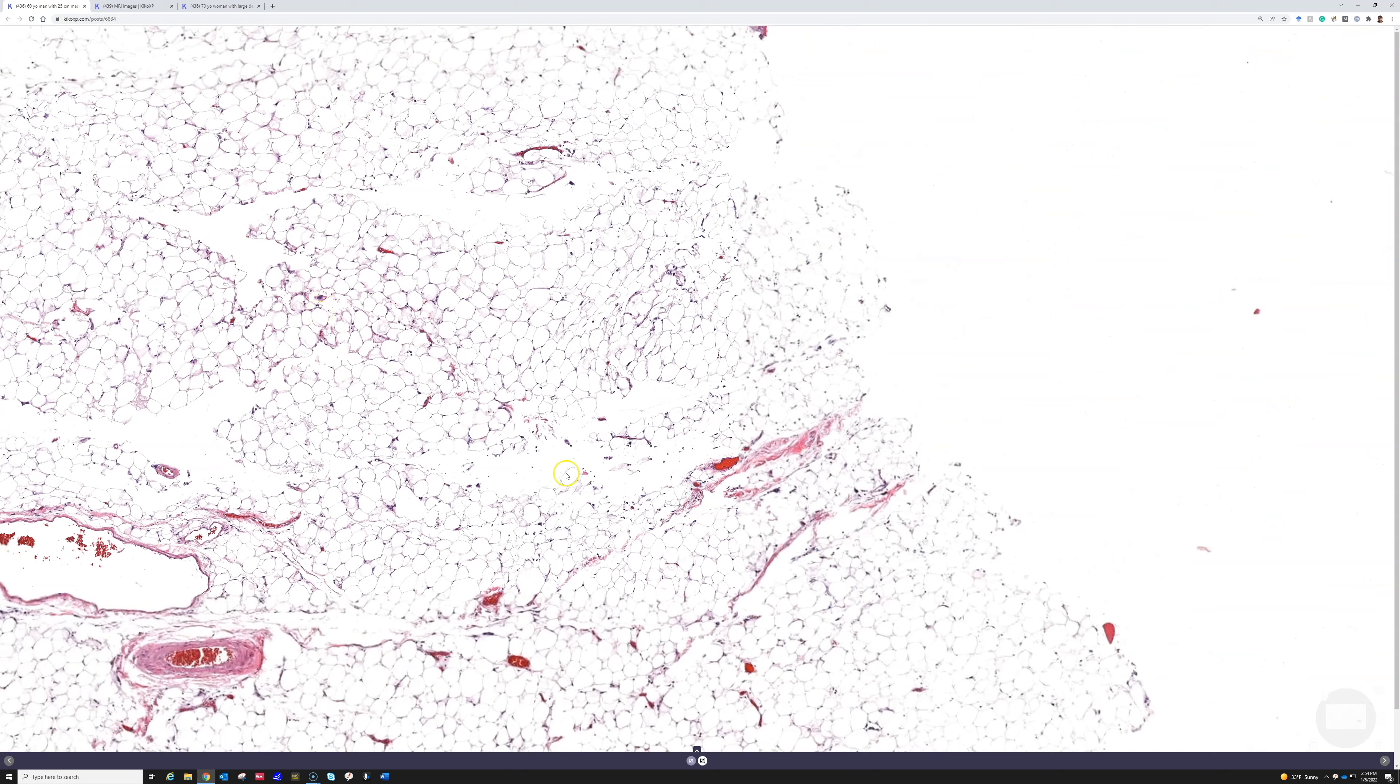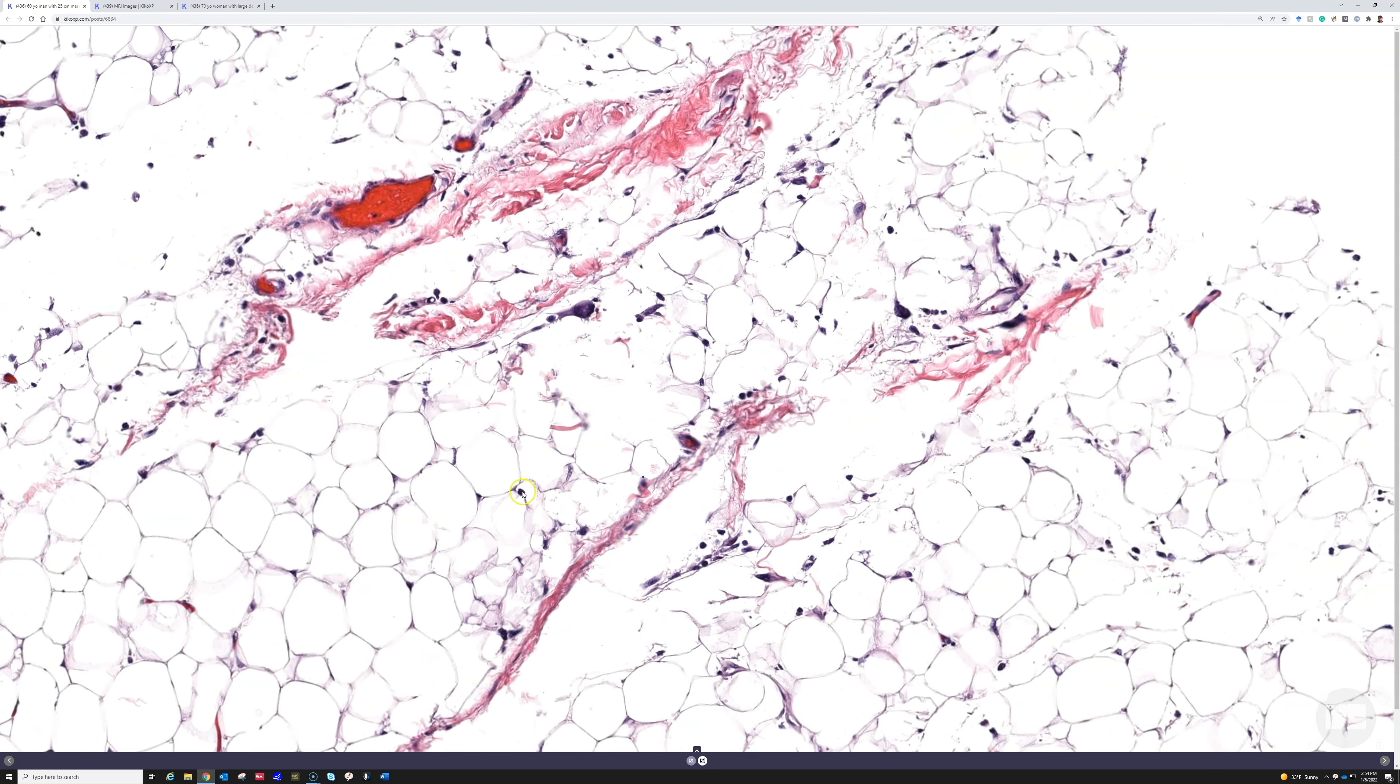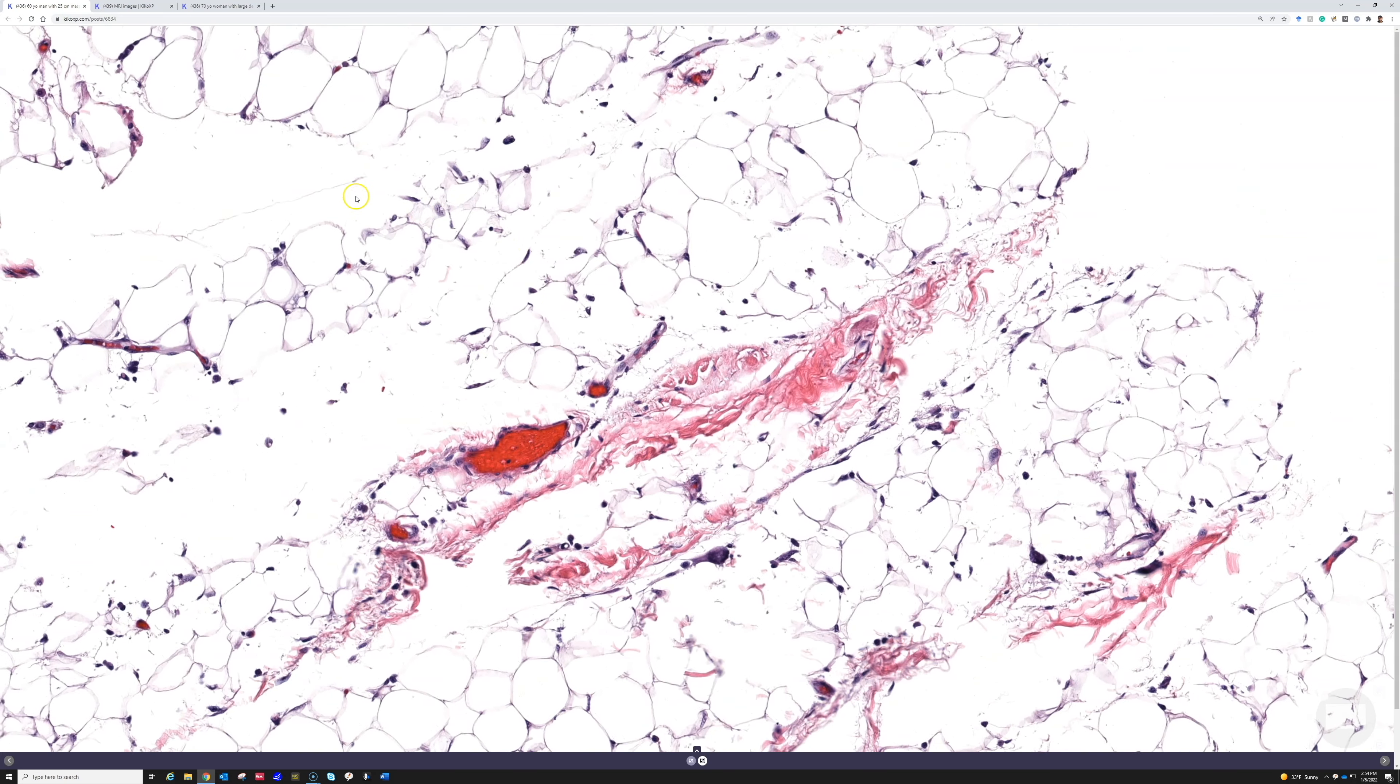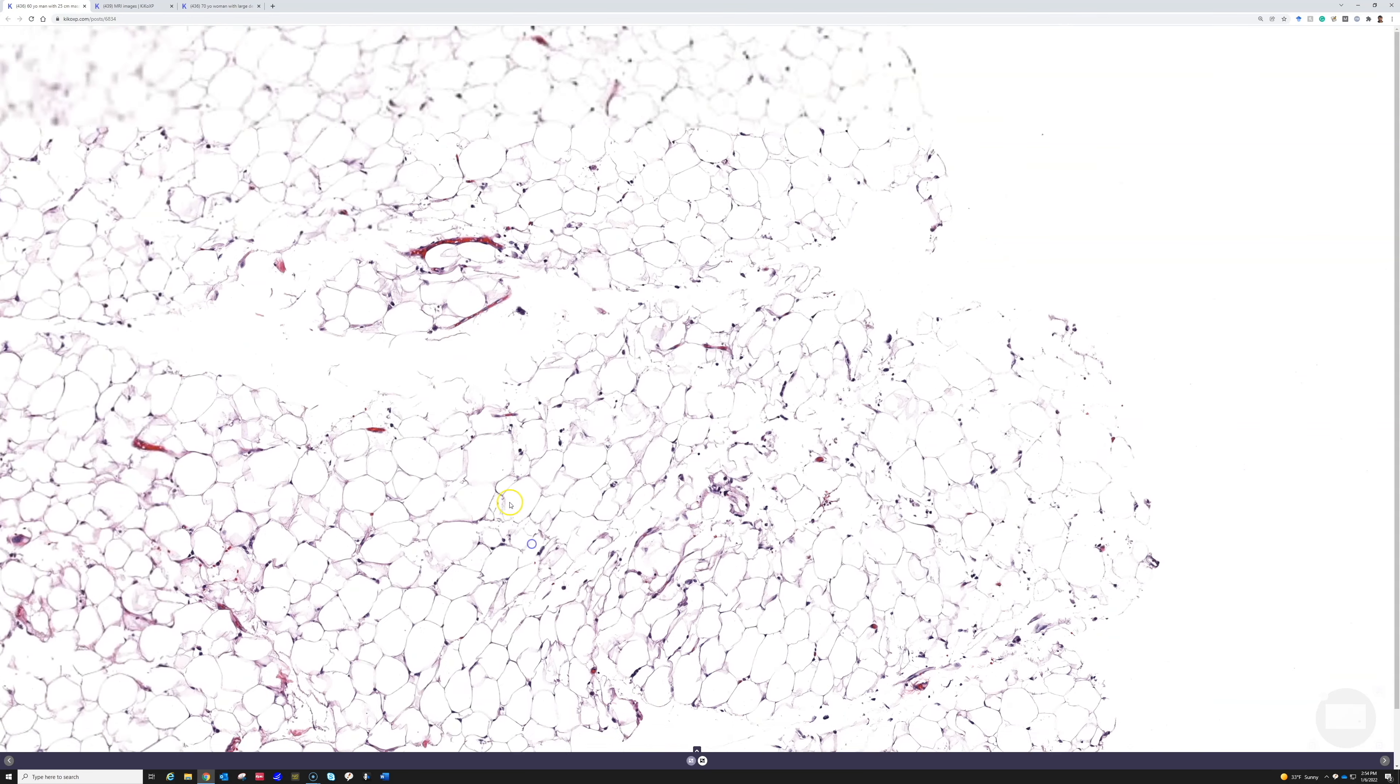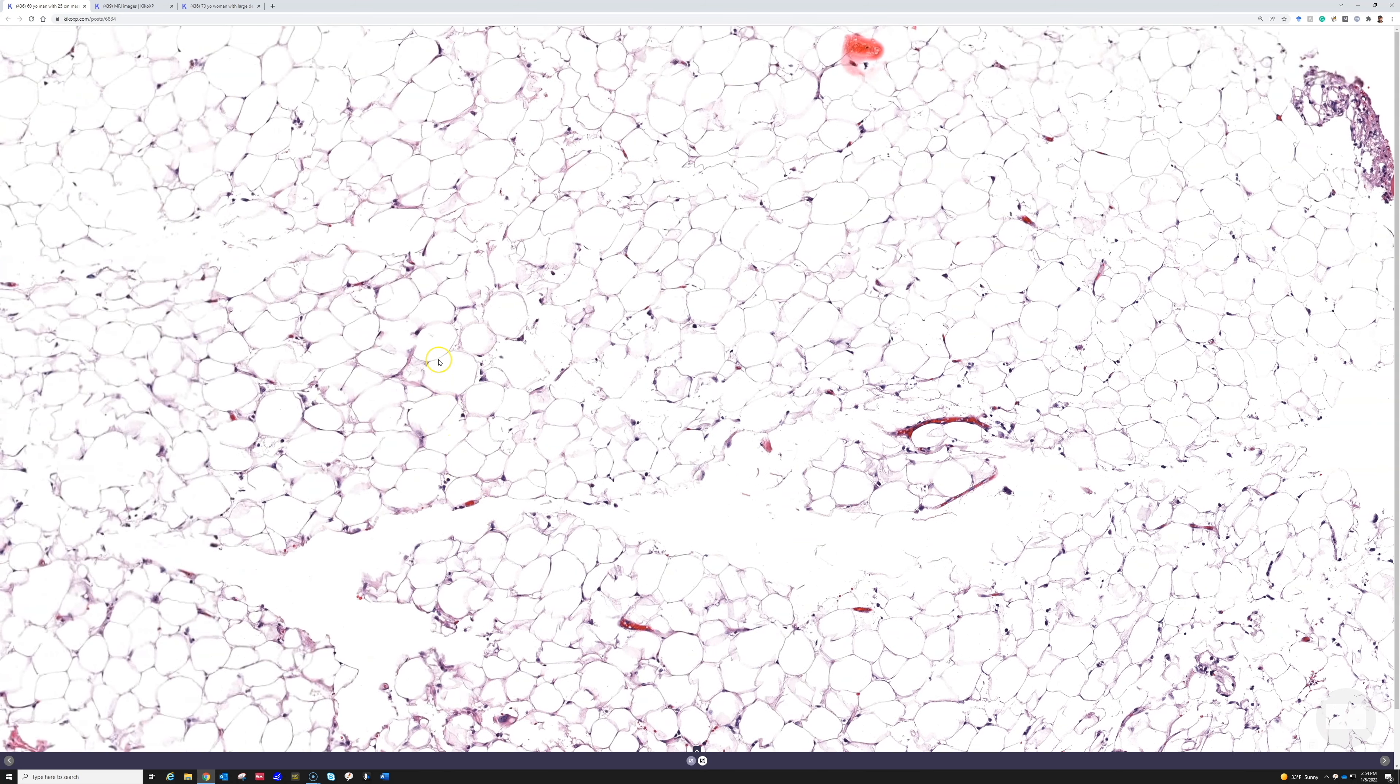And so that it can be very focal, but usually the cells are so atypical that even from like a 4x magnification objective you can usually see them. You don't usually have to hunt around on high power. Even from lower power they'll stand out. And there may also be lipoblasts. There may be fat necrosis in here too. Um, sometimes fat necrosis in a lipoma can mimic ALT.